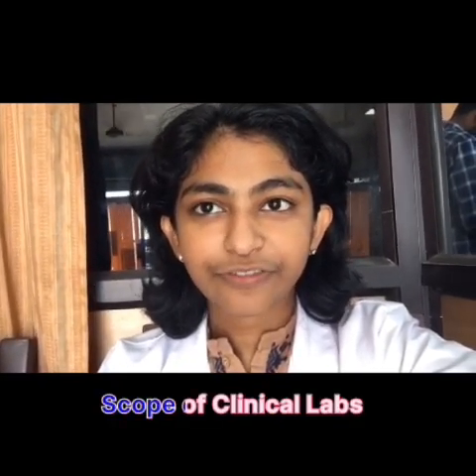Video I'm making regarding my internship. So for my internship, I decided to come to Dr. Samsun Immunoclinical Research Laboratory, and the scope or working of any clinical laboratory is where patients will come in after consulting a physician, and we have to collect samples, which is mostly blood samples or urine samples, and we have to process those samples by performing microbiological, biochemical or immunological techniques to determine if there is presence or absence of pathogen, or we can also quantify any substance present in the sample.